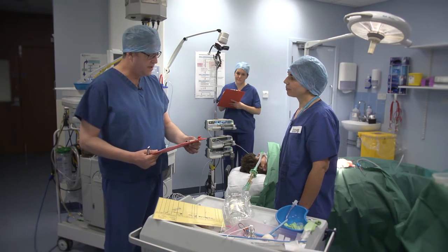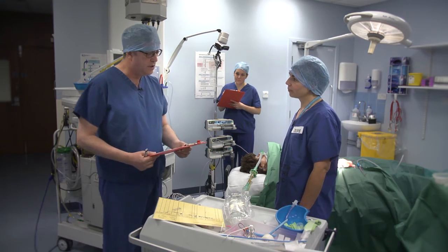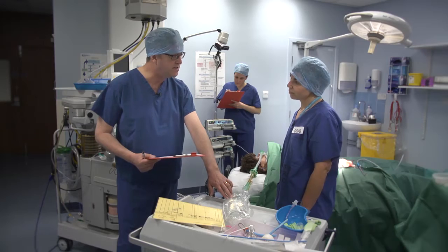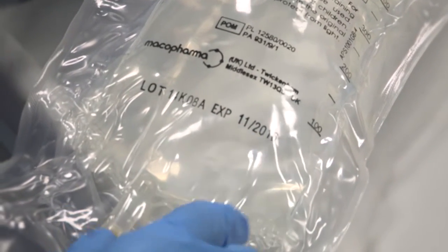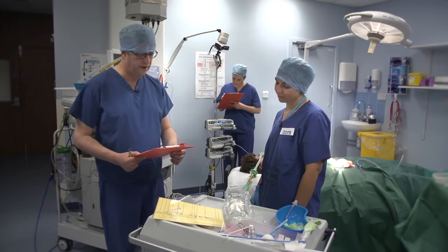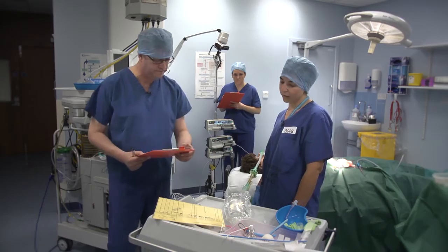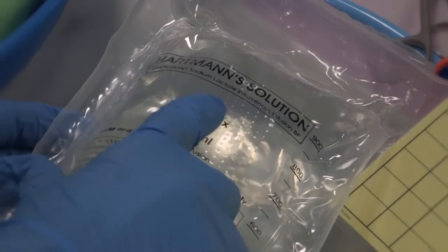The scenario now is that the anaesthetist has asked you to replace the Hartmann solution. Could you please look at the bag, find the expiry date and read it out to me? So that's 2016. Does that mean it's in date or out of date? That's in date. Next, could you please read the information on the bag and tell me whether this is correct based on what the anaesthetist wants?